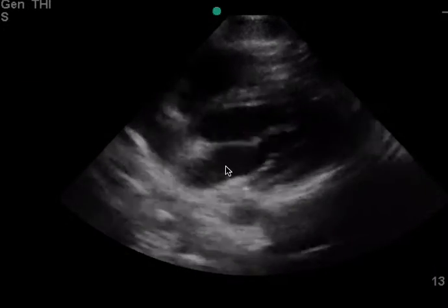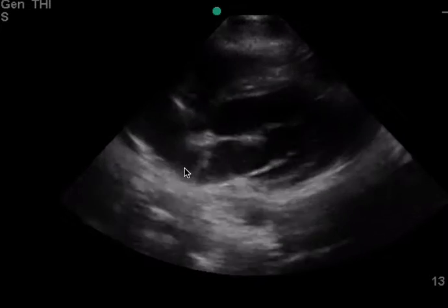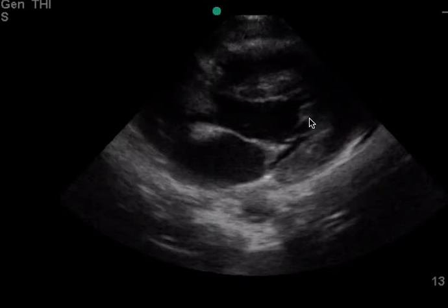So here it looks like you are again trying to get the parasternal long: left atrium, left ventricle, aortic outflow tract. First off, the probe is backwards. Normally the left ventricle should be here, left atrium with the aortic outflow tract going this way, but here the probe is opposite. So my guess is that you're holding the indicator to the patient's right shoulder as opposed to the left hip. You want to then turn the probe either clockwise or counterclockwise to try to optimize your angle.